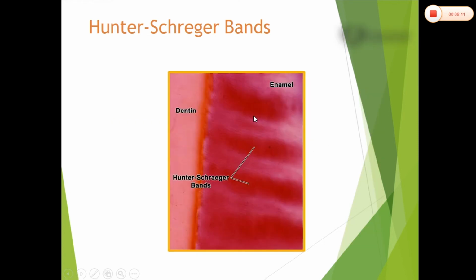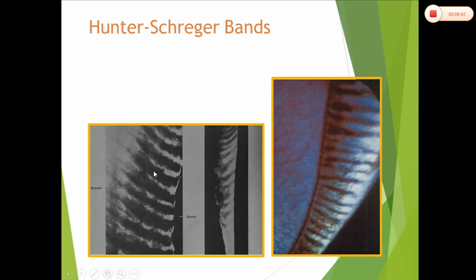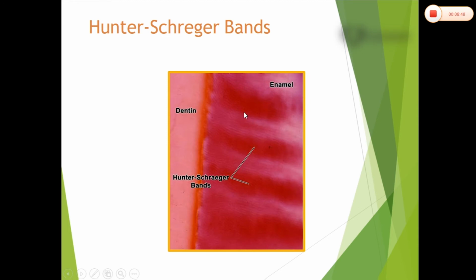This is a demineralized section. Here, ground section. But here, demineralized section. So you can observe Hunter-Schreger bands.